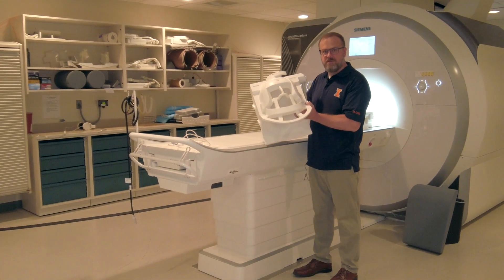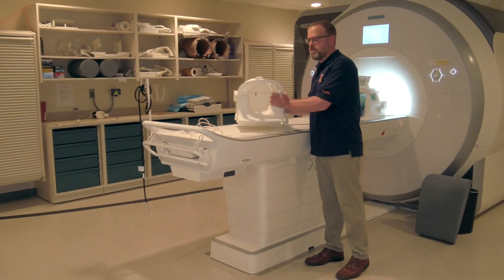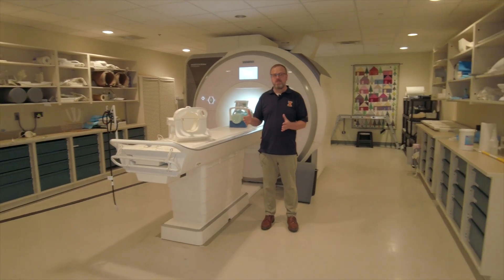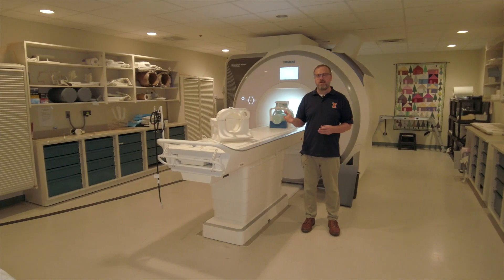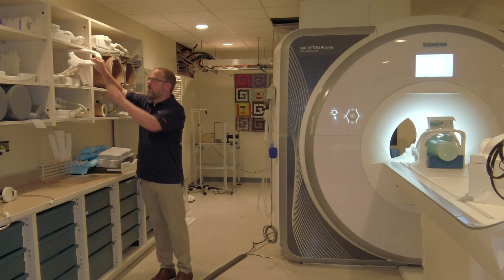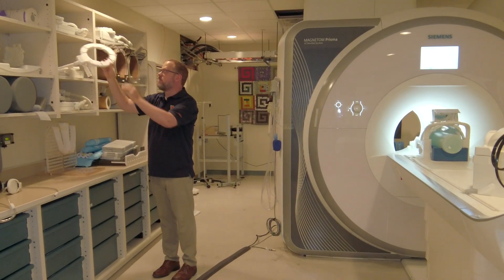The 64 channel head coil has lots of individual receiver elements to be able to pick up on signals associated with different parts of your brain. This is a multi-nuclear system, so in addition to just protons for imaging, we can do other nuclei too. We have things like phosphorus coils, which are loop coils, which let us see 31P in the scanner instead of just protons.